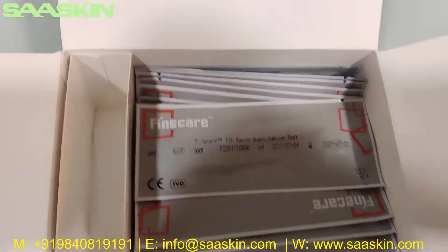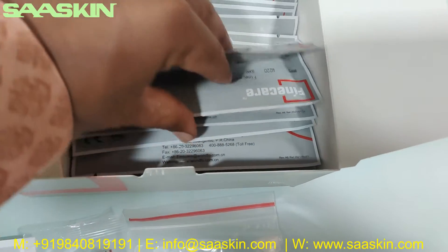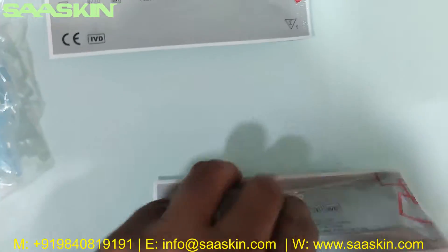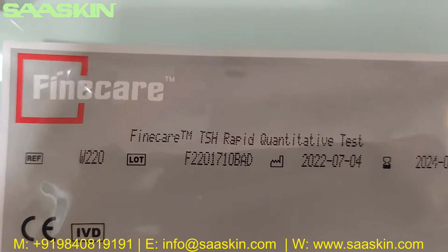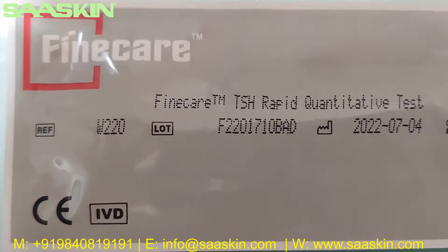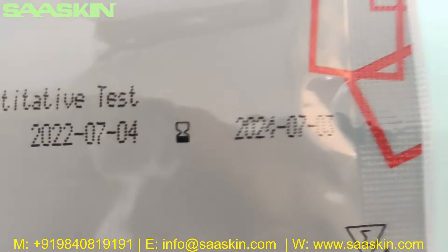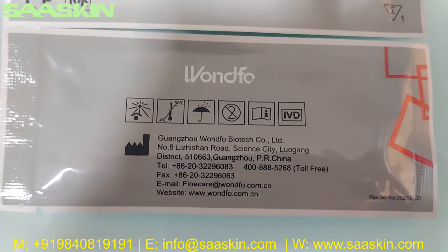Inside, you can also have 25 cartridges. Let me take two cartridges out. Each cartridge says 'Finecare TSH Rapid Quantitative Test' and shows the reference part number, lot number, manufacturing date, and expiry date. The other side shows the manufacturing location.